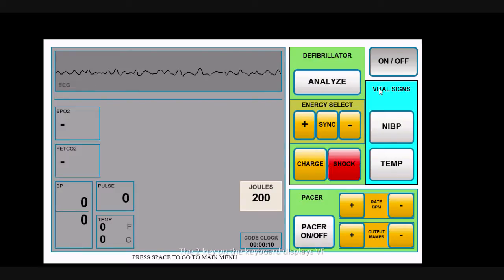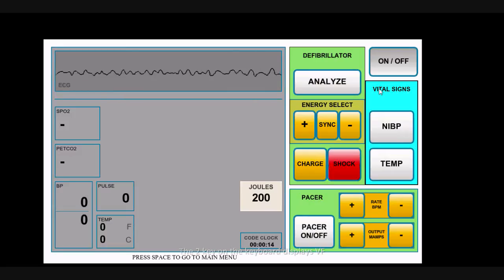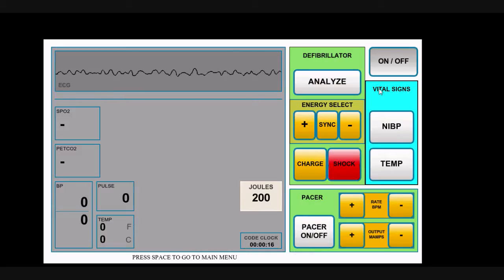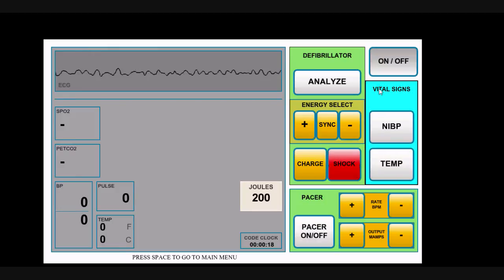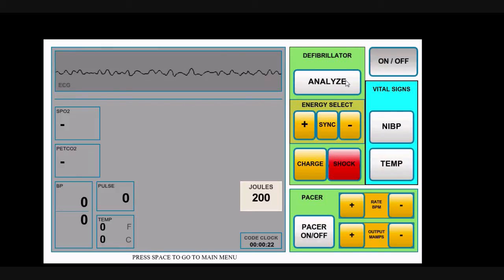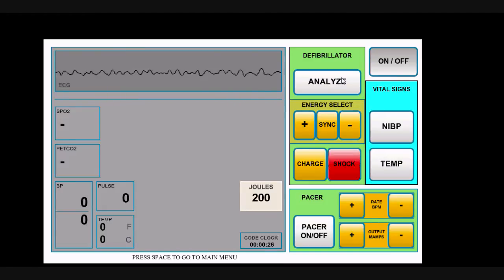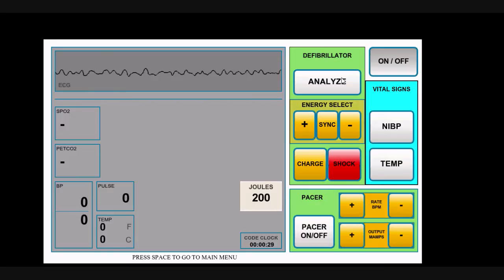Now the student can respond to this in a couple of ways. They can do a more traditional manual charge and shock by adjusting the dose, hitting charge, etc. But if you'd like to incorporate a little bit of AED training into this, they can also just hit the Analyze button, and I'll ask you to listen here carefully to the audio that's displayed from the product. I'm going to hit Analyze.